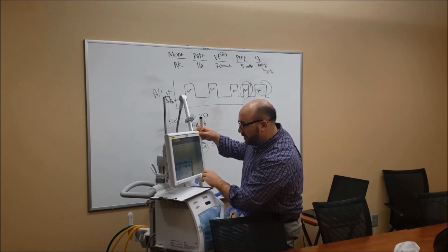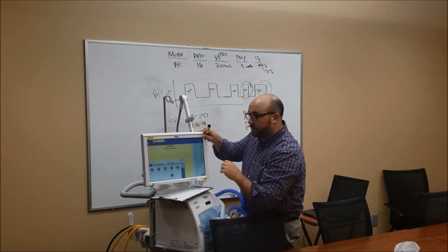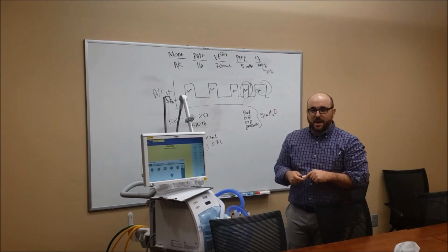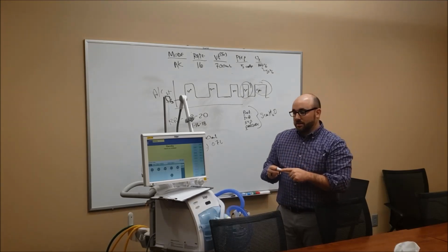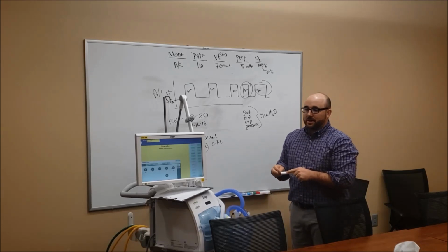I'm just gonna make it real funky. Okay, so first person, what's your name? Jamie. Jamie, okay, thank you. Jamie, how would you read those settings to a nurse upstairs?